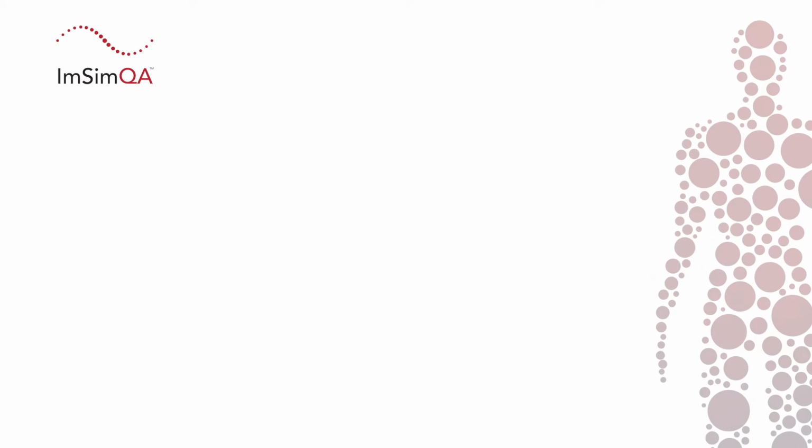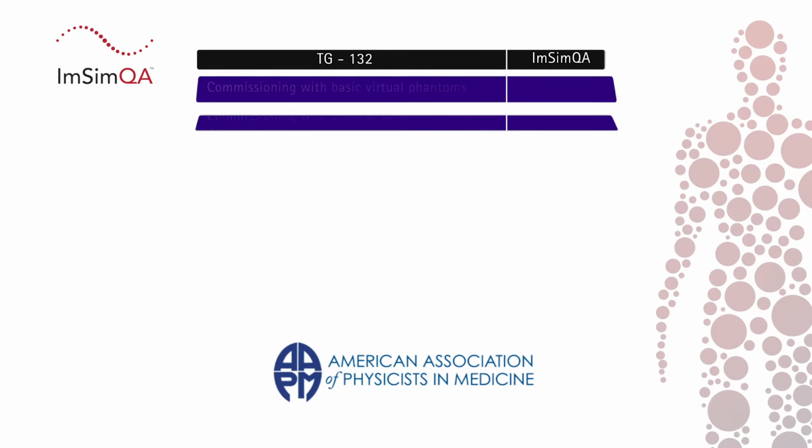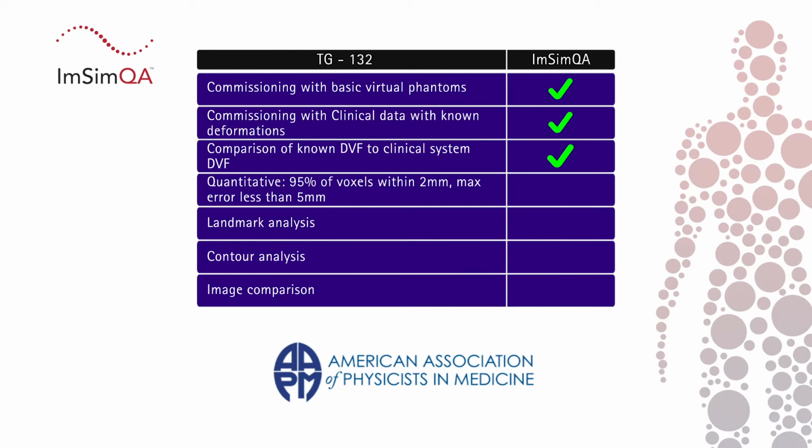Developed to support the recommendations of the AAPM Task Group 132, ImSimQA provides radiotherapy centers with the only commercially available quality assurance package for image fusion and DIR. This enables commissioning and ongoing QA of imaging software systems in radiotherapy.